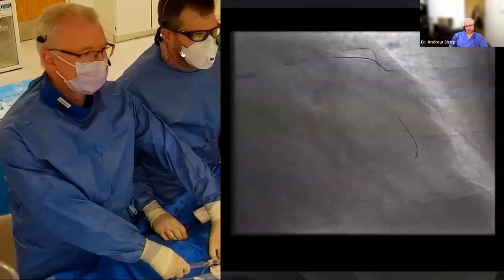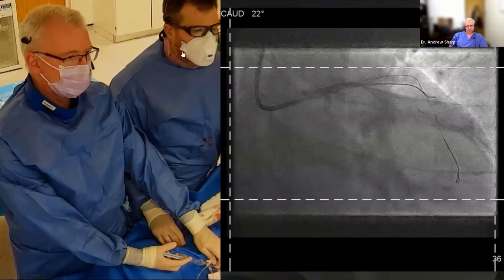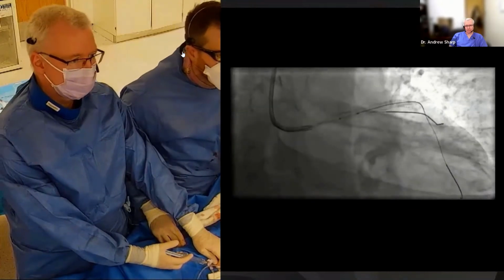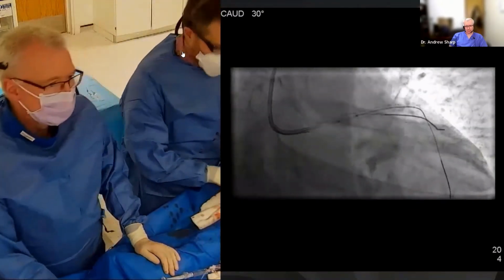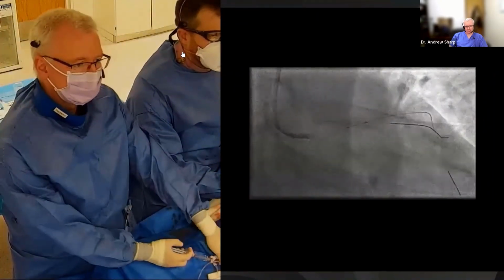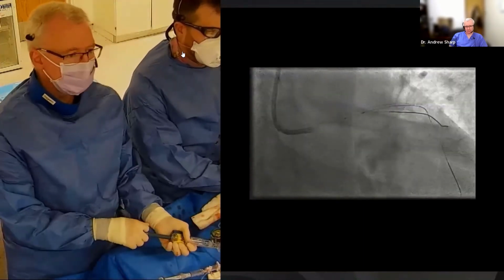So centre up, boys. You're probably a little too out, proximal then. Yeah, okay. No, you're good. So we're a bit too proximal there, but that's okay. I think we accept that. That's it, it is what it is. Yep, that's fine. We're in the stent now.